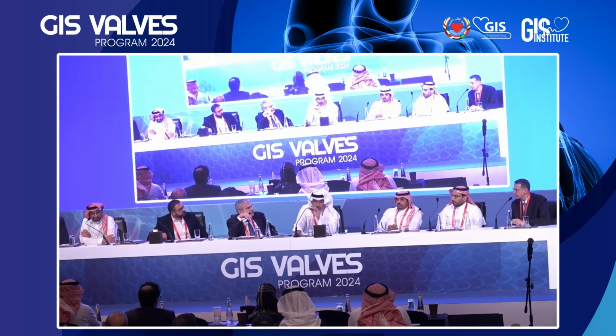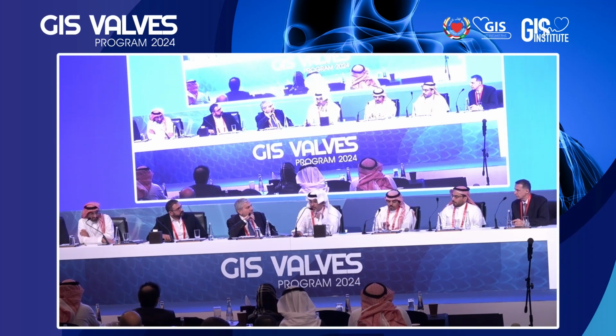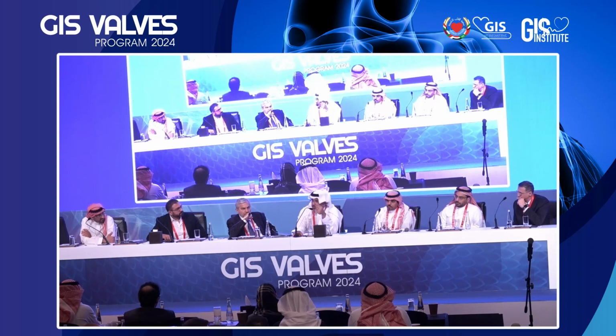I think the live transmission took us to a different alley here, unfortunately. So rather than filling the time, I wonder, with this case specifically, type 1 calcified raphe, the majority here will predilate to test the compliance, not necessarily to size. But you presented a case yesterday with type 0. Would you treat type 0 any differently, or does the same rule apply, you still predilate all bicuspid valves?